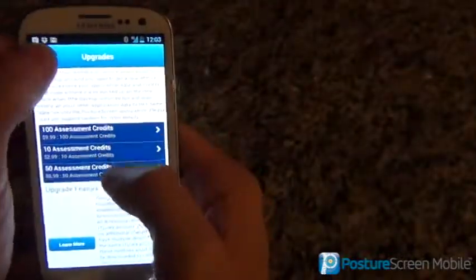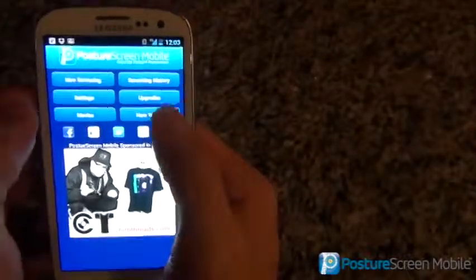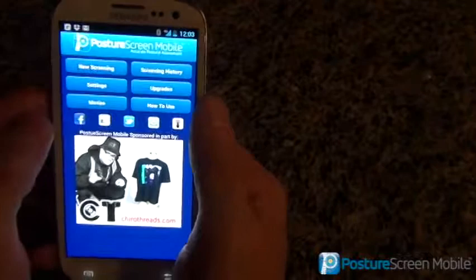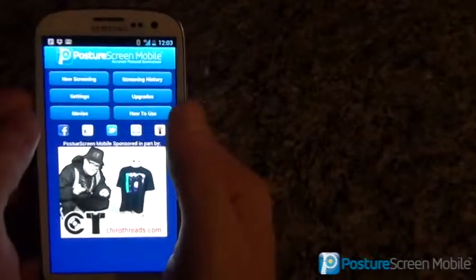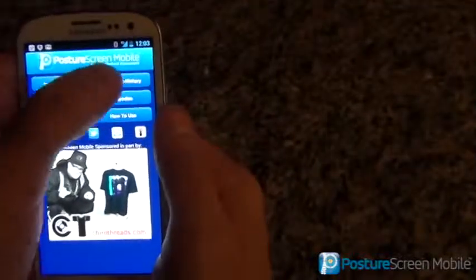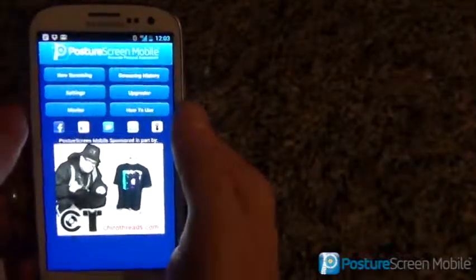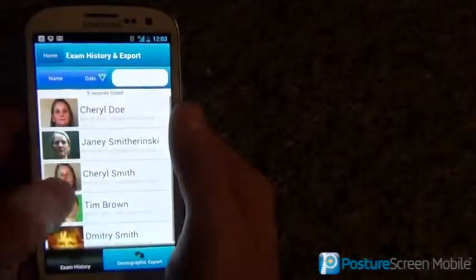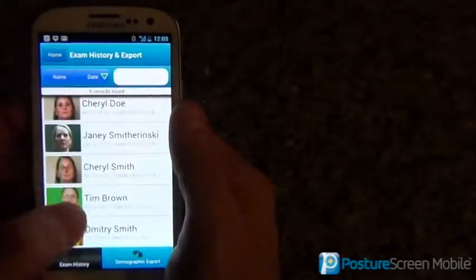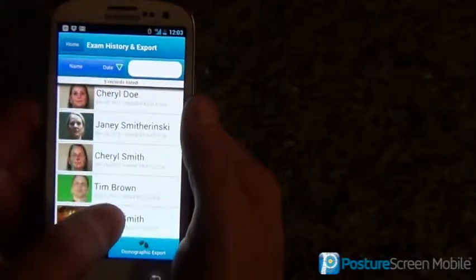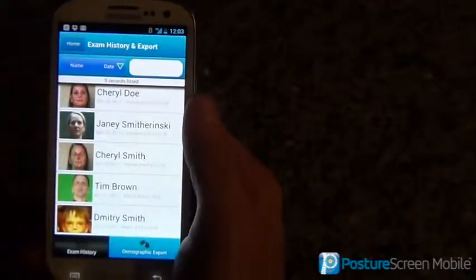Let me go back to the home. So if I wanted to do a comparison exam, first of all we go into Screening History, and let me go into Dimitri Smith.